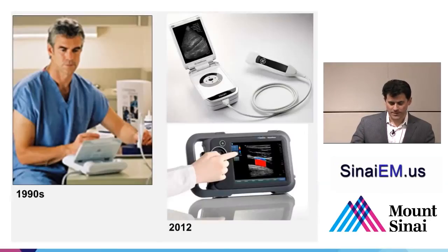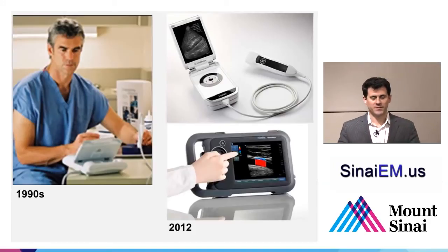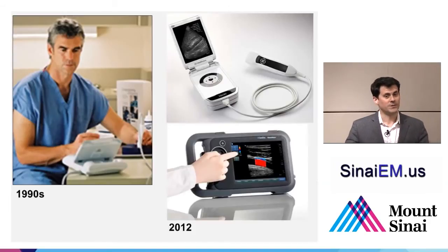But it wasn't really until the 1990s, as part of a DARPA initiative through the United States government and the Department of Defense, where ultrasound was actually used in a portable fashion, portable enough for a soldier to carry, portable enough to be used by medics in the field, portable enough to not have wheels anymore, but a handle. And that really opened up the possibilities for use outside of traditional imaging areas like radiology, obstetrics, and cardiology into the hands of emergency physicians, intensivists, and other groups.